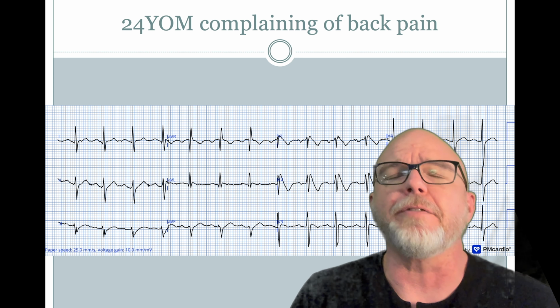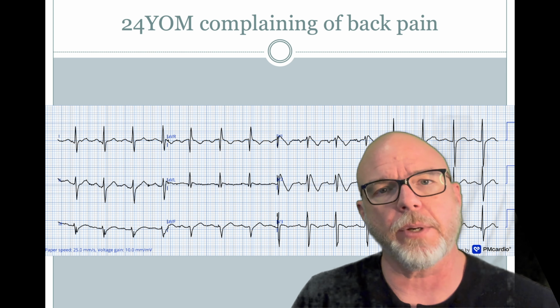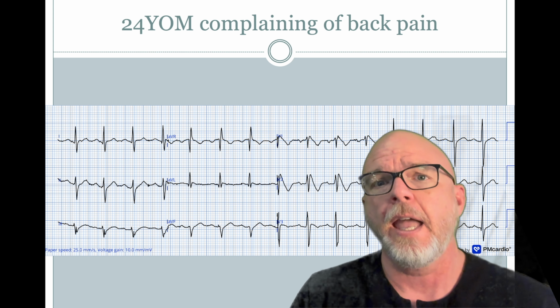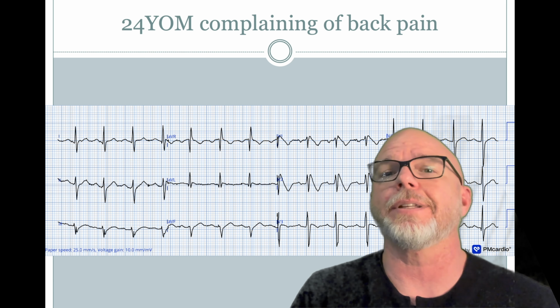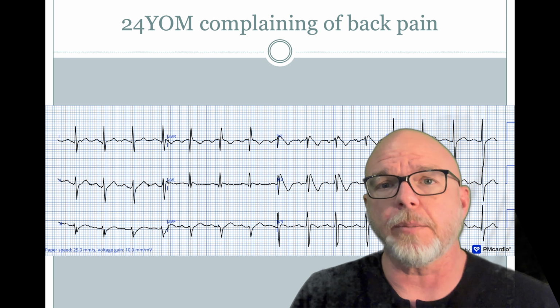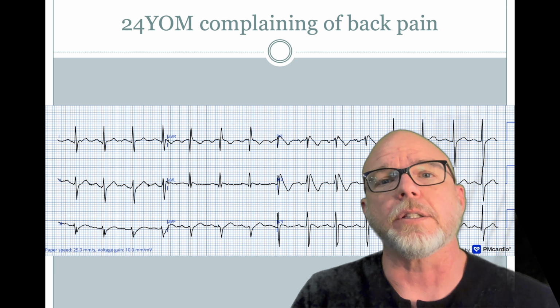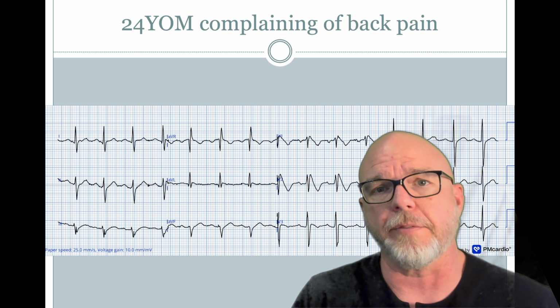But this crew did a fantastic job by evaluating the back pain and found out that it's not atraumatic back pain. It actually comes from a fall. And evaluating that fall a little bit more, they discovered that it wasn't actually a fall. It was a syncopal event. And because it was a syncopal event, they did the right thing and put the patient on a 12 lead and potentially saved the patient's life.